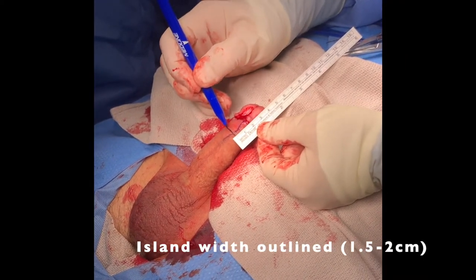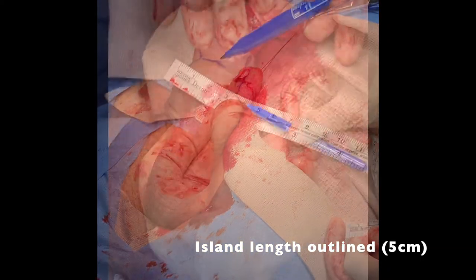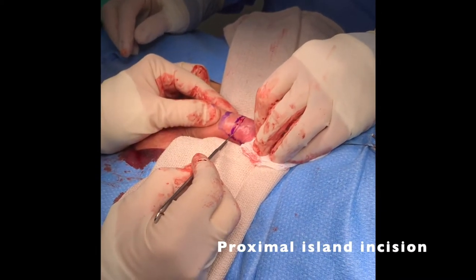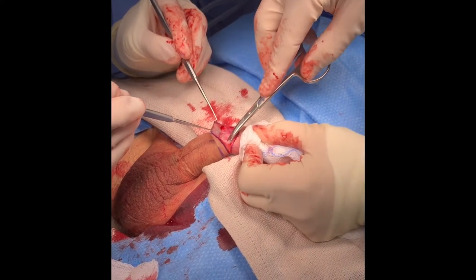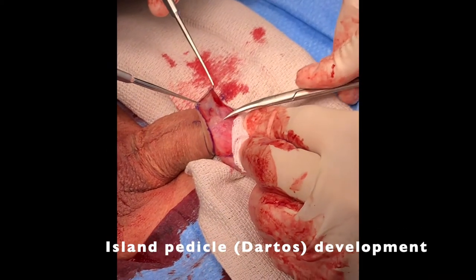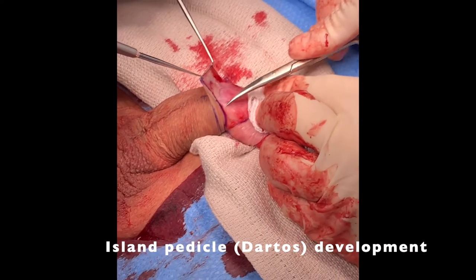We outlined the penile skin flap from the ventral penile skin, measuring 5 x 2 cm. Next, we made the proximal incision, delineating the skin island. This incision was only carried down to the Dartos layer, preserving the underlying vascular pedicle. The flap was developed by dissecting proximally while lifting the skin down to the level of the mid-penile shaft.